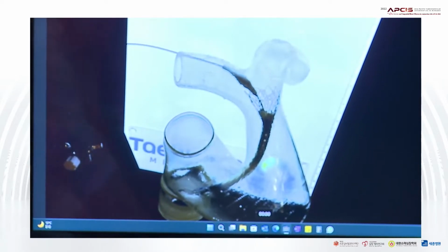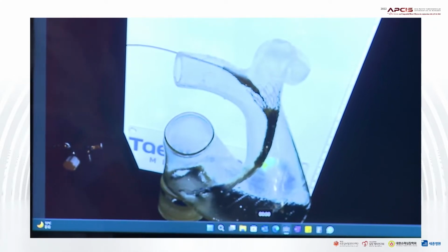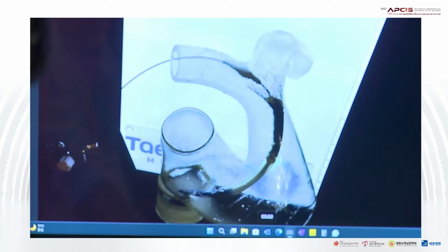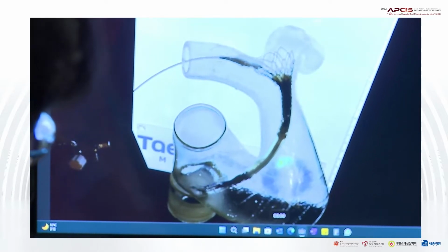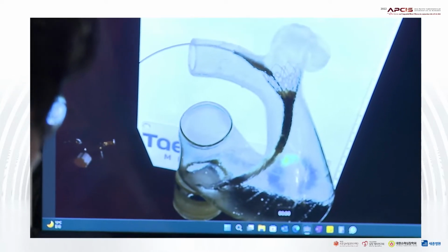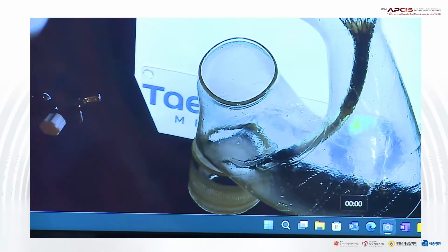I think the valve is slightly distal. Distal? Too much proximal, okay. I think proximal. Then we can advance a bit. Okay. All right. Now you will open more. Open more. Okay. I think the level is not bad, so we can do the total flare. Yeah, right? I think so.